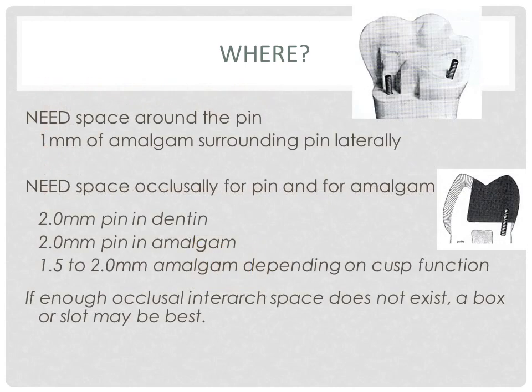We need 1 mm of space around the pin. This space is to accommodate the amalgam. On the occlusal, that is, above the pin, we need 1.5 to 2 mm of amalgam, depending on the cusp, functional or non-functional.